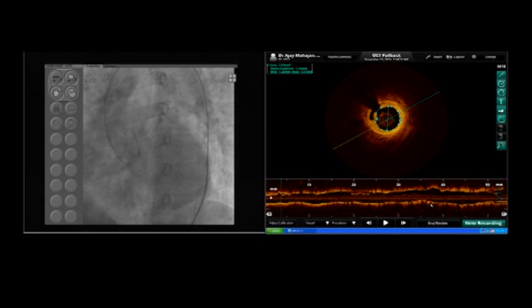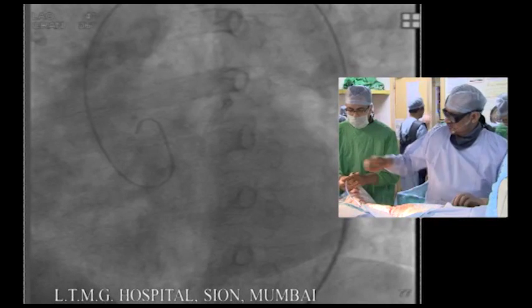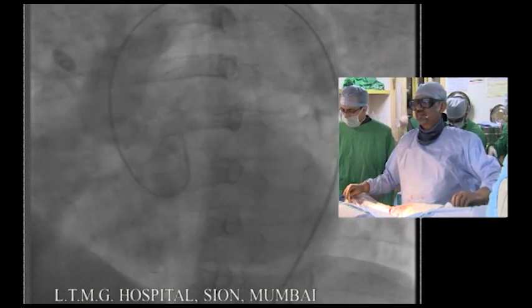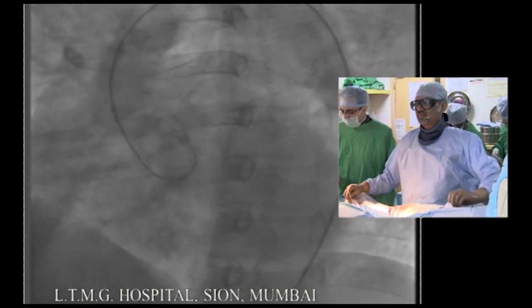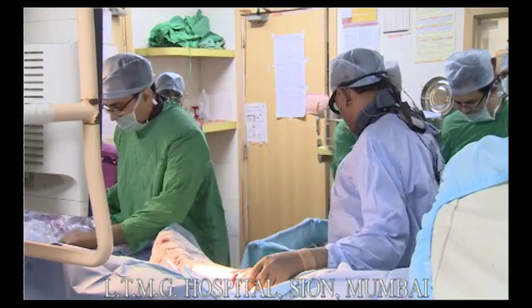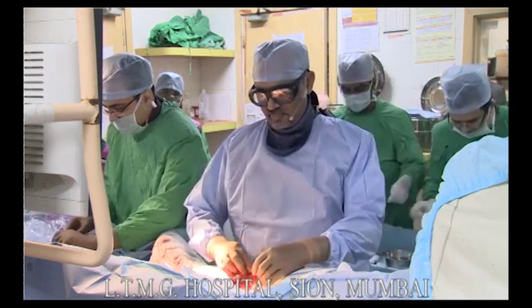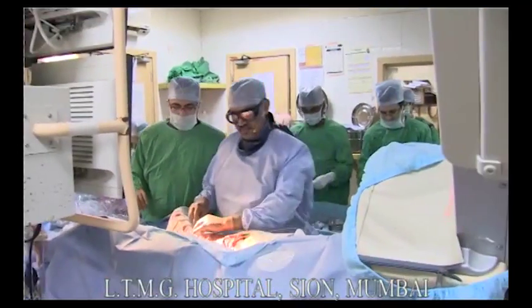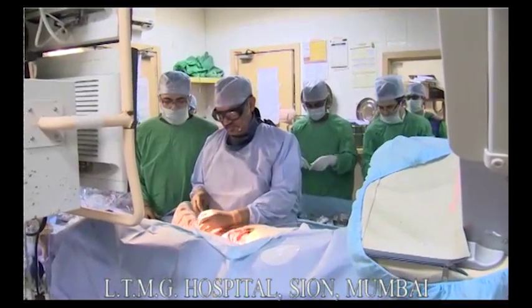Okay, so we have to move on, Ajay, but please give us an update when you come back here again. Thank you very much for showing this patient with the complex LAD lesion using good guide catheter support and also guide liner. Thank you very much, and OCT use as well. Thank you, sir. And thanks to Dr. Hamazaki as well.